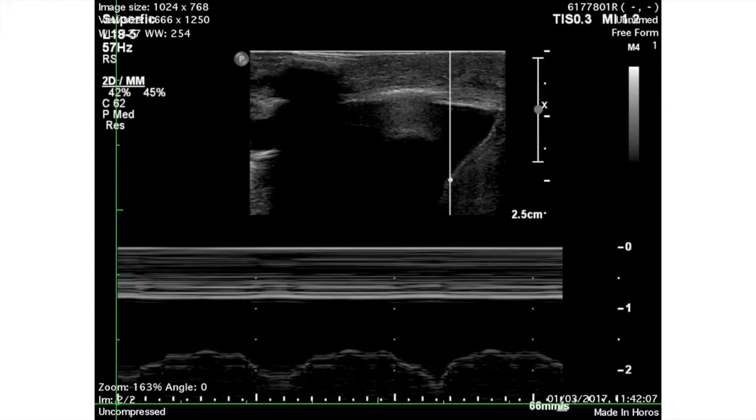In adults and pediatrics, you can even quantify the amount of fluids. In neonates, it can inform you about the level of fluid effusion, guide your needle or drainage, and monitor your treatment.